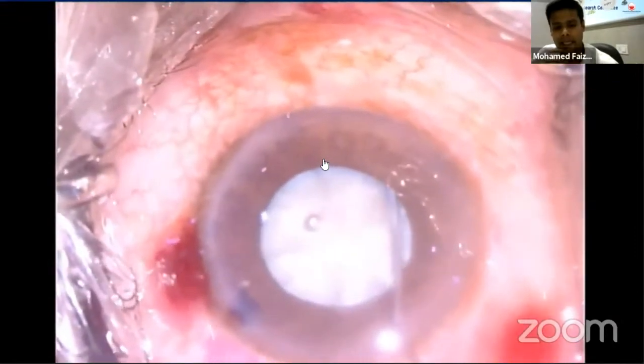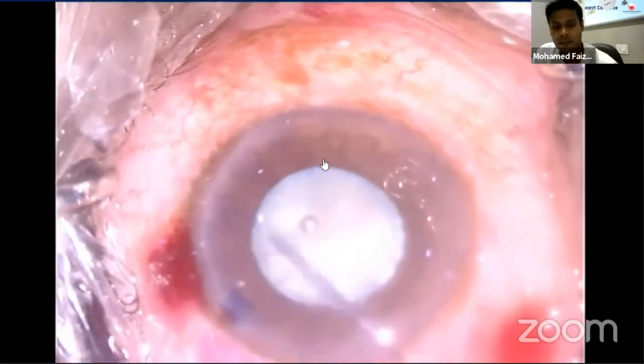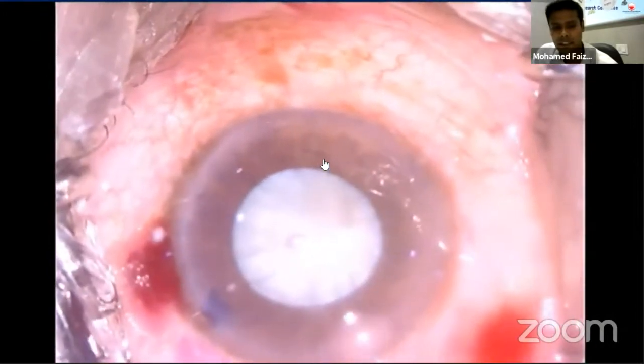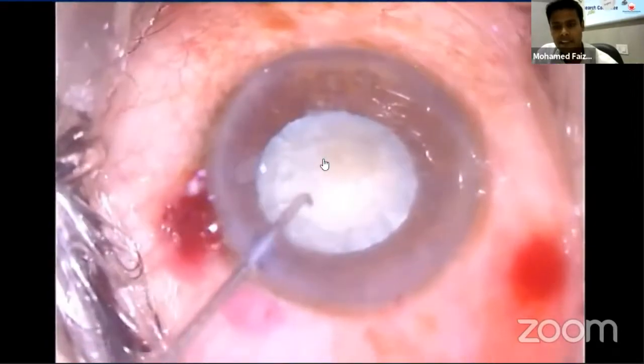Next is good hydrodissection, as the divide and conquer technique requires rotation of the nucleus, so good hydrodissection is mandatory. Then come the FACO settings: moderate flow, low vacuum, and continuous FACO power is needed.